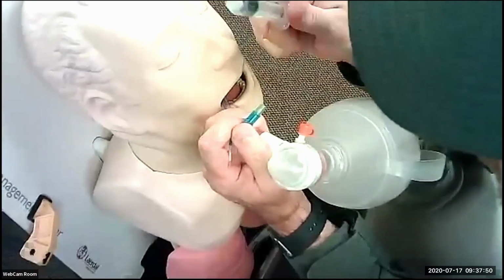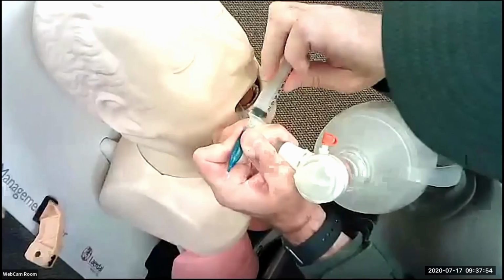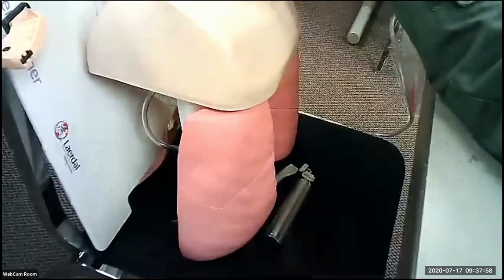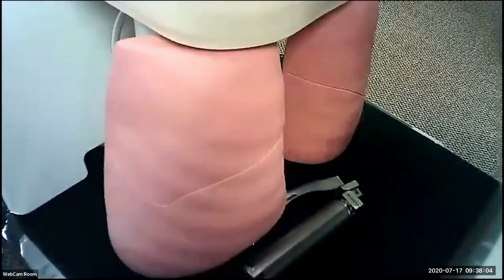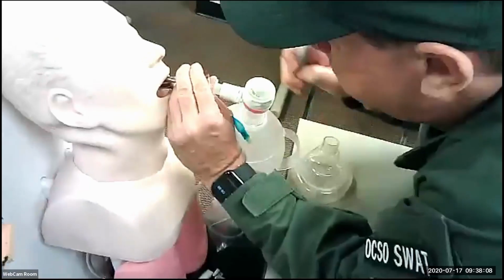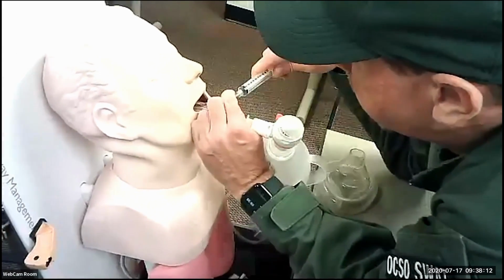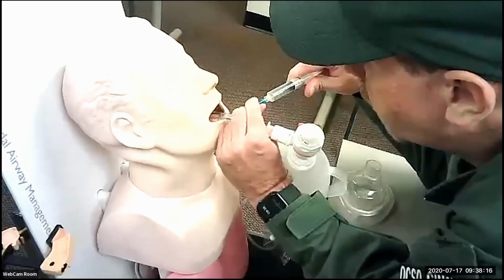All right, so I'm going to inflate this with about 6 to 8 cc's of air. This is a push. All right, so now you'll see the one lung. I'm getting a little bit on the other side, but more on the right. All right, that's too deep. So I'm going to pull back out a little bit. I'm going to deflate this so we do not traumatize the trachea or our windpipe.